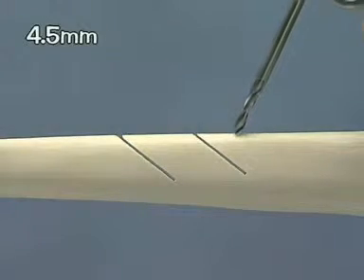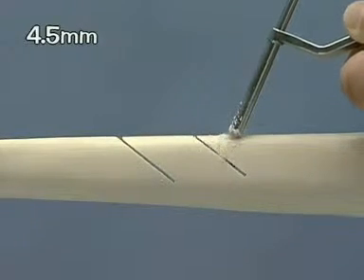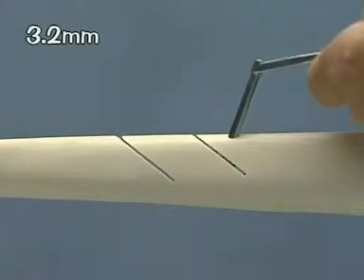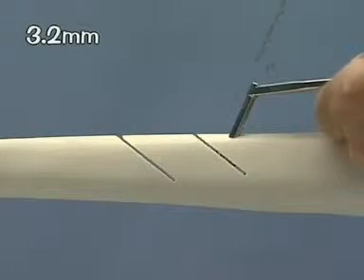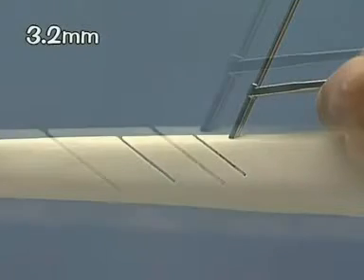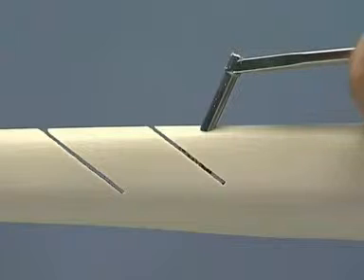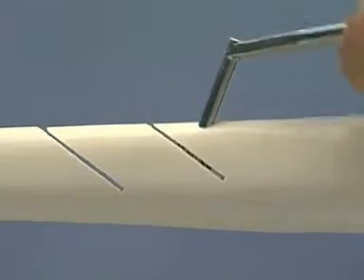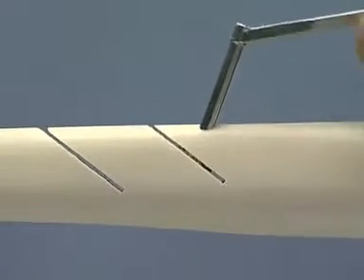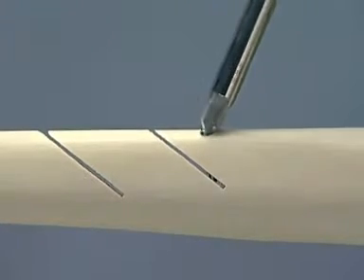Drill the gliding hole with the 4.5 mm drill bit through the near cortex, approximately perpendicular to the fracture line. Insert the 3.2 mm drill sleeve and, with the 3.2 mm drill bit, drill the thread hole through the opposite cortex. Countersink the hole for better seating of the screw head.